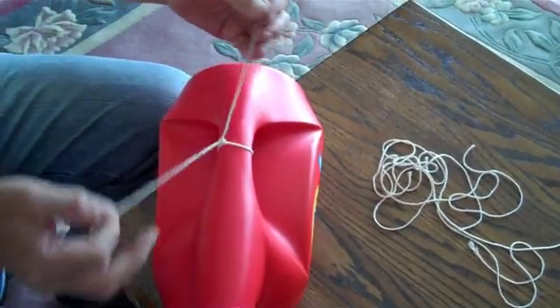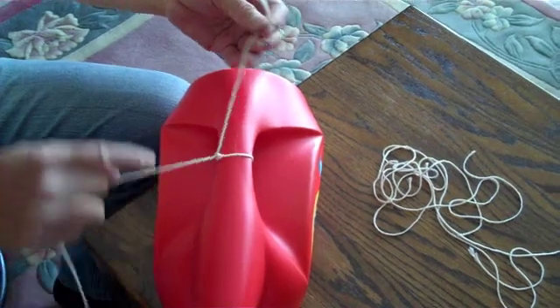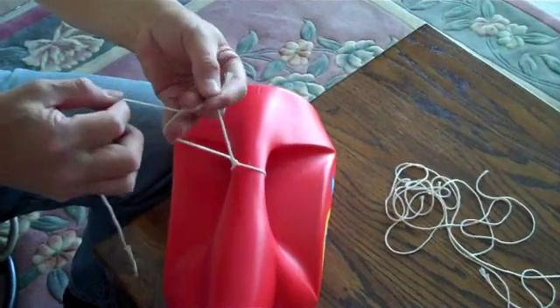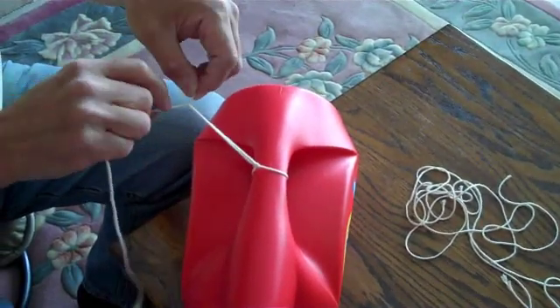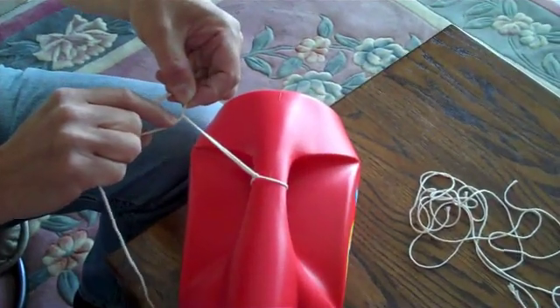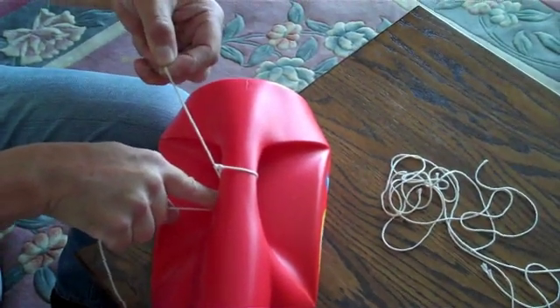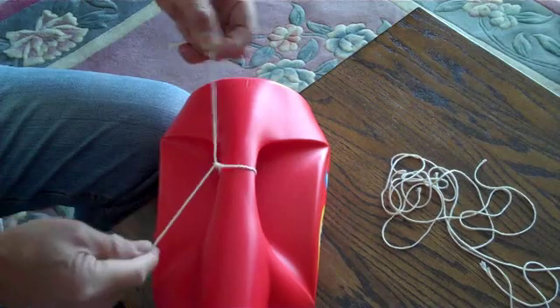Now if you're in a deep body cavity and you need to tie the knot down, you can do it this way. Because you're in a deep cavity, you use your index finger to slide the knot down. Tighten it. Tighten it.